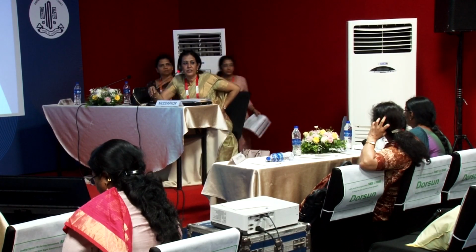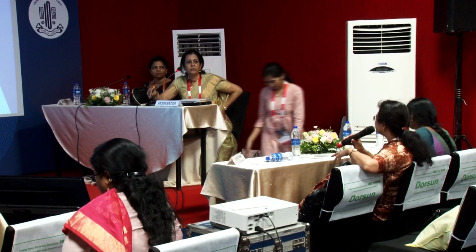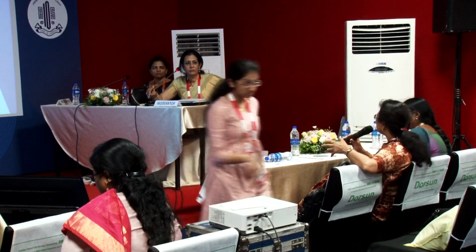Do most of these challenges get obviated, Dr. Vanati, with an IOCT? I think an IOCT is an added advantage, especially if you are assisting your residents and fellows in a training program. It helps to minimize the intraoperative events here. That's it, and I think we all trained without the availability of an IOCT. So we are still adept at doing the same whenever we are doing it. Okay.